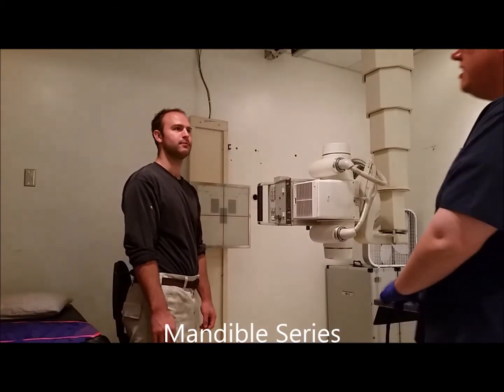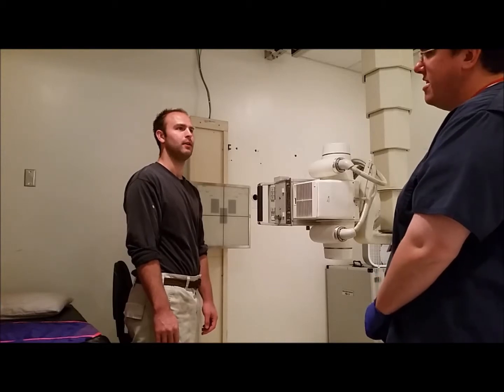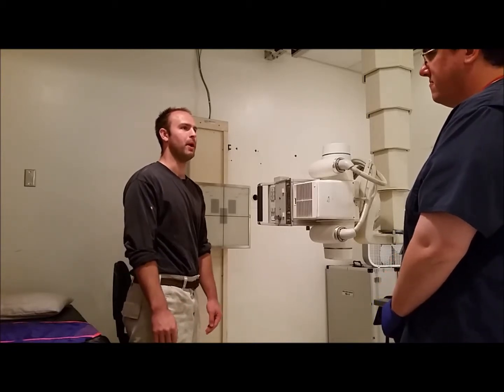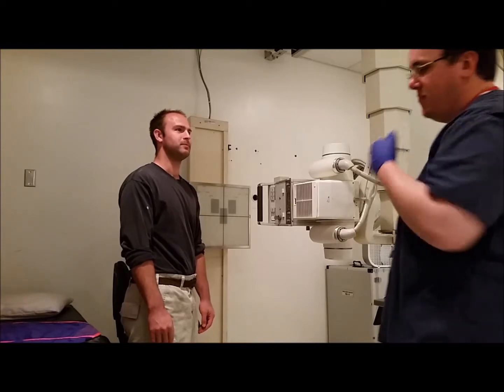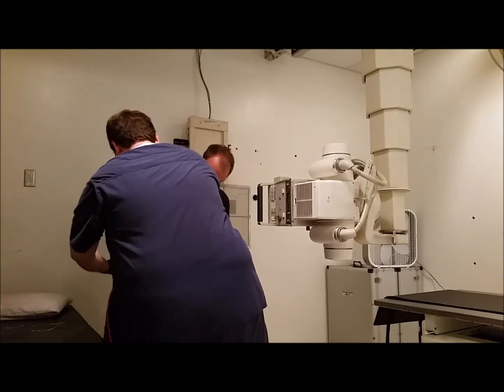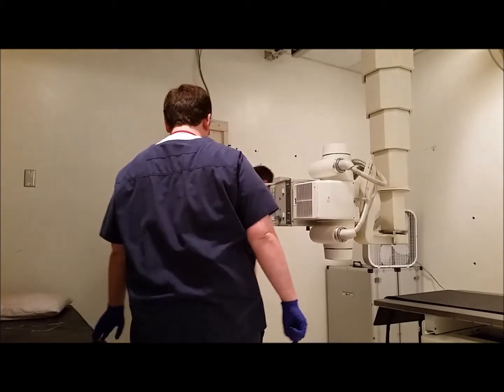All right, Mr. Scolati, can you give me your birthday, please? June 8th, 1988. Alrighty, and what's been going on here? I've been having pain on my right side of my jaw, and it's because I've been wrestling with a bear. What the berries say, really? Yeah. Okay. Well, we'll have you put on some lead here. Let's take our images. Let's see. There we go. Nice and tight. So I have you sitting in the chair here.